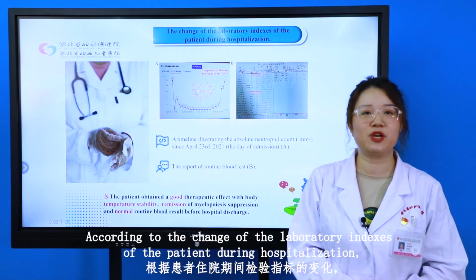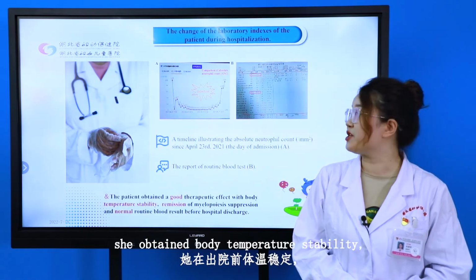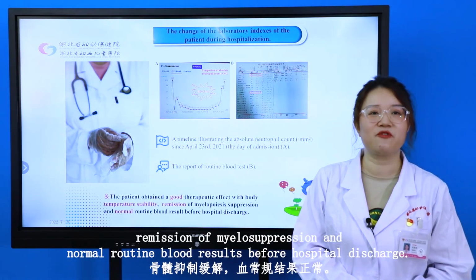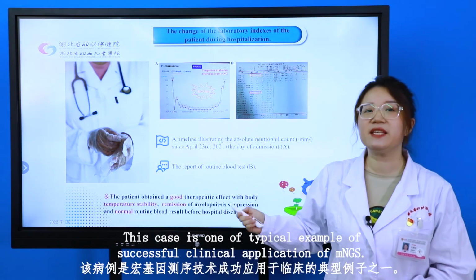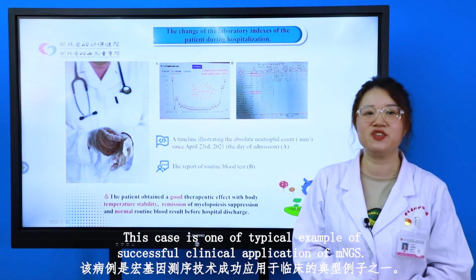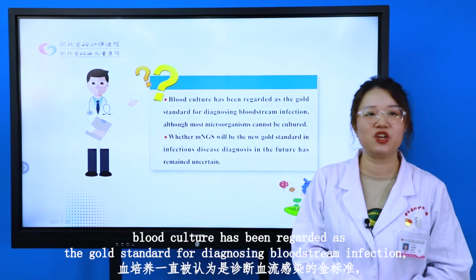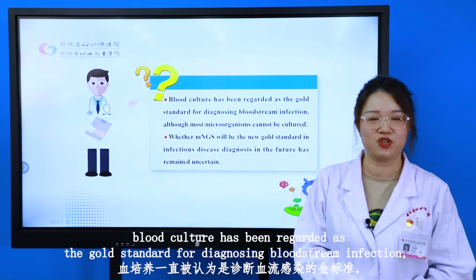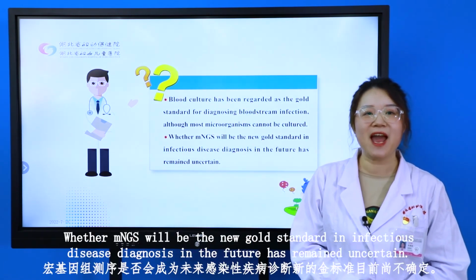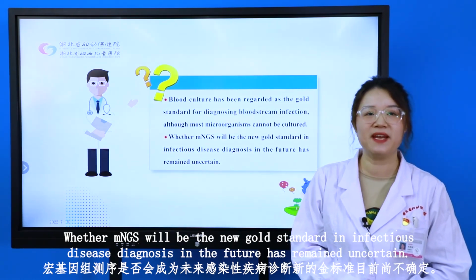According to the changes in the laboratory indexes of the patient during hospitalization, she obtained body temperature stability, remission of myelosuppression, and normal routine blood results before hospital discharge. This case is one of the typical examples of successful clinical application of mNGS. As we know, blood culture has been regarded as the gold standard for diagnosing bloodstream infection, although most microorganisms can't be cultured. Whether mNGS will be the new gold standard in infectious disease diagnosis in the future remains uncertain.